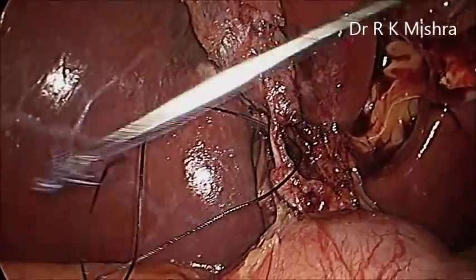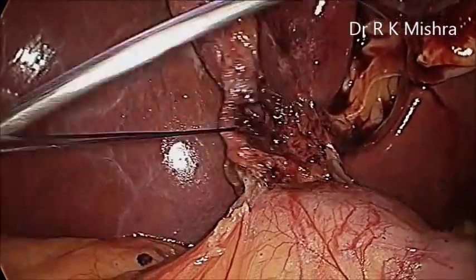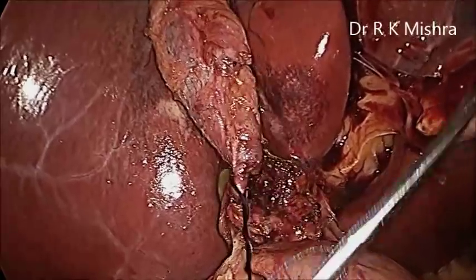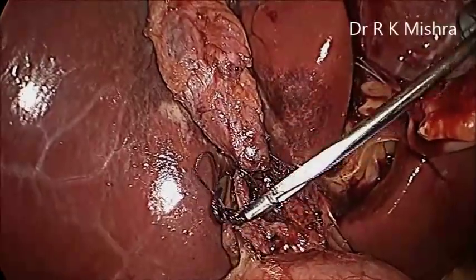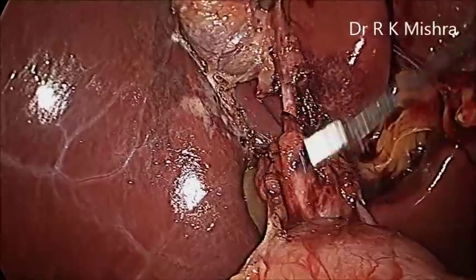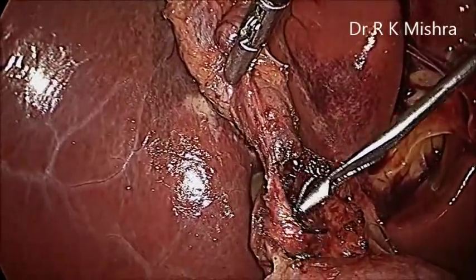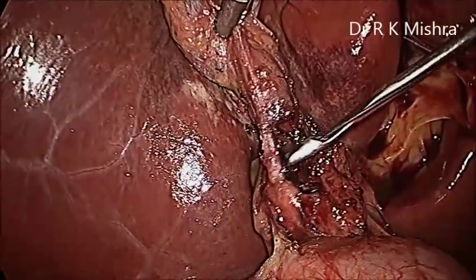You should try to avoid going directly there at the level of the structure where you want. First you should bring the knots smaller, and then you should go to the structure where you want to tie. In the beginning only if you go, it won't be good. You should negotiate it. At this point traction should be avoided. We can see here that there is no traction given, and then let the knot itself go to the junction, because by default the knot itself will go to the narrowest area and it is very secure, it is tightened.